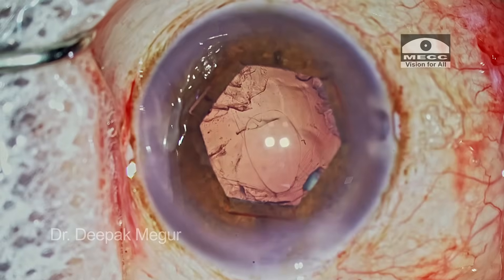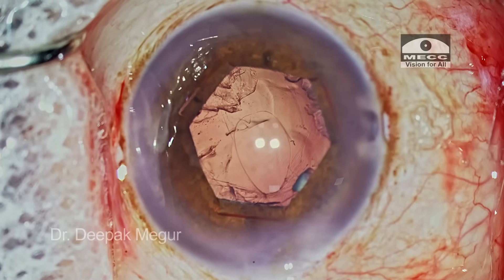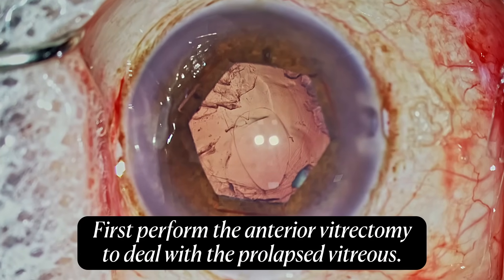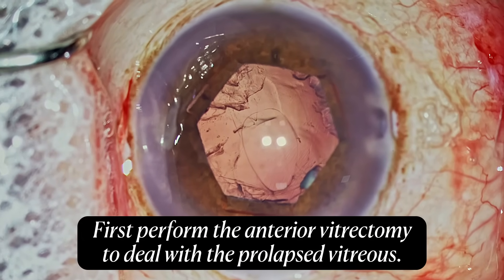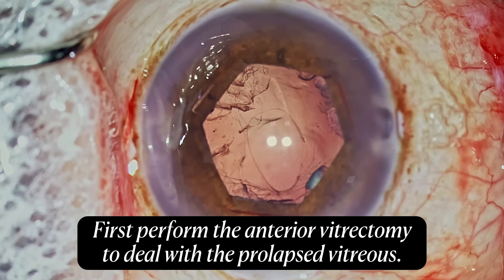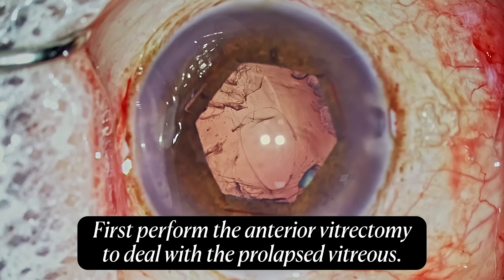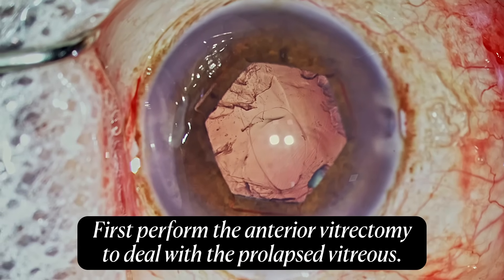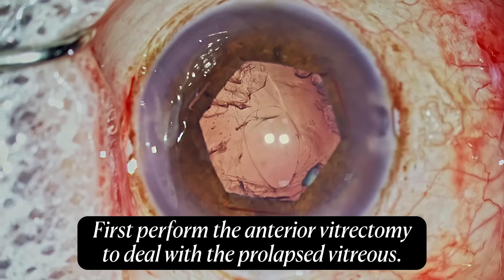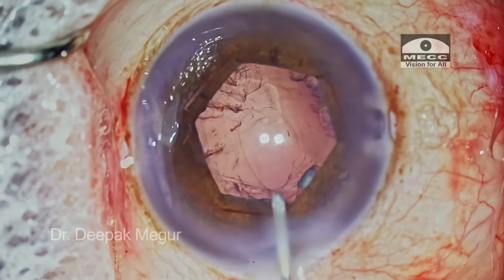Assuming that you have written your answers, let me continue with the case. Obviously, the first thing to do is vitrectomy. We cannot venture to remove that fragment without dealing with the vitreous first, because that deserves our primary attention and needs to be dealt with.